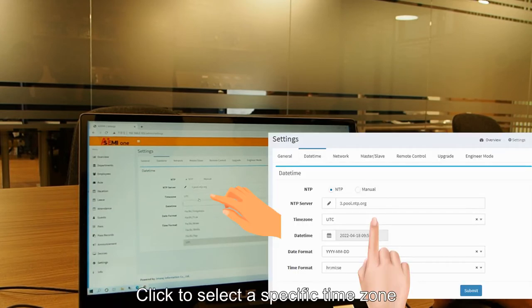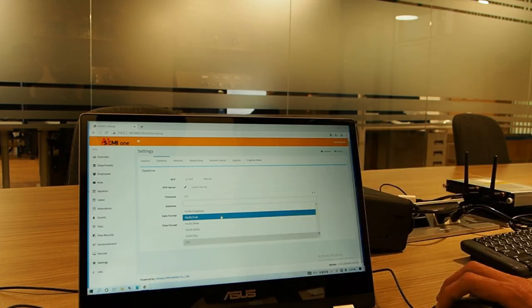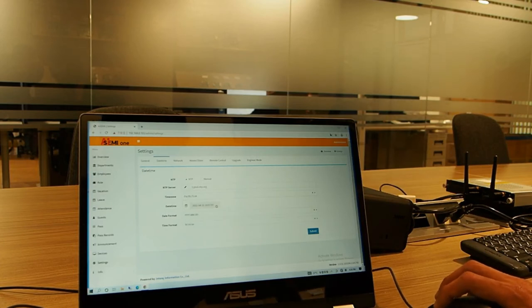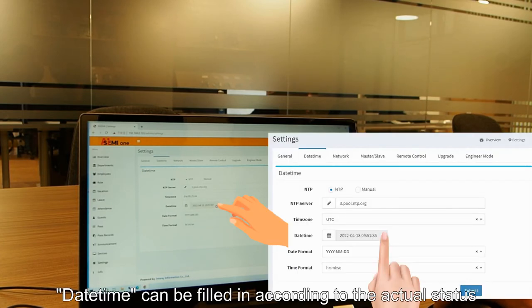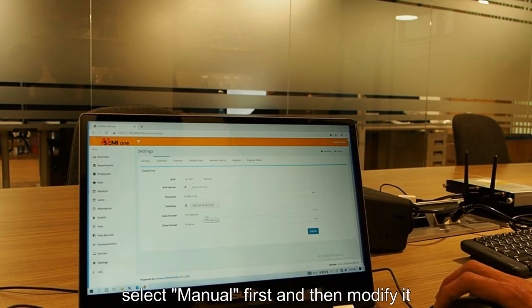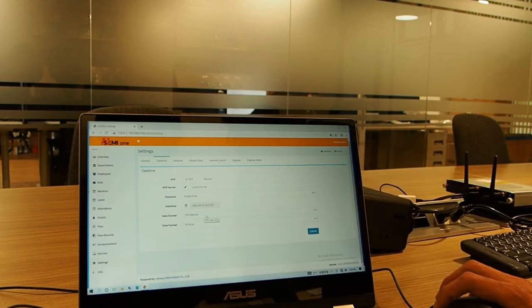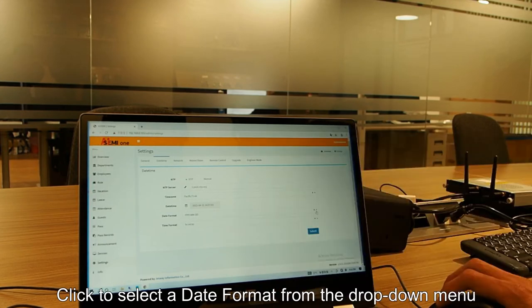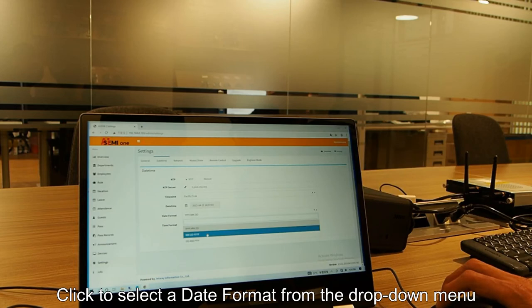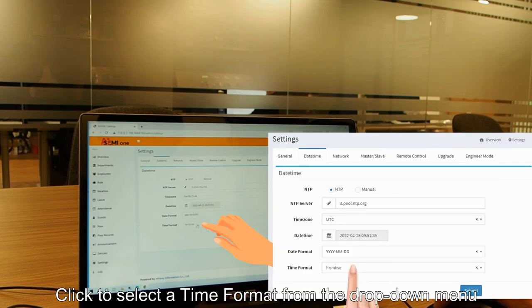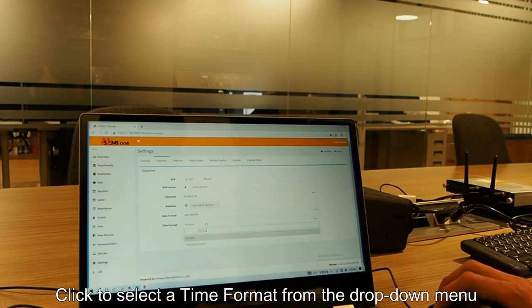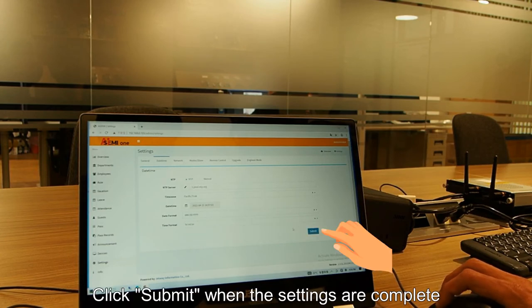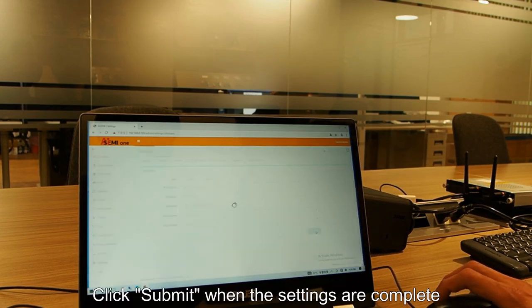Click to select a specified time zone from the drop down menu. Click to select a date format from the drop down menu. Click to select a time format from the drop down menu. Click submit when the settings are complete.